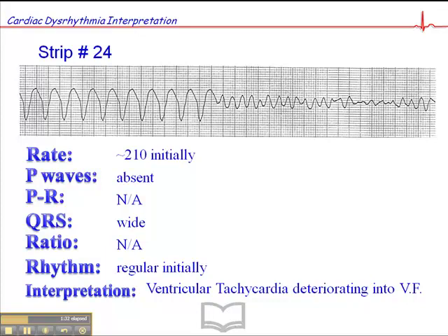Both of these are shockable rhythms, meaning they are rhythms that are appropriate to defibrillate. That might take place with some upfront CPR if this is an unwitnessed arrest, or might take place immediately if this is a witnessed cardiac arrest.